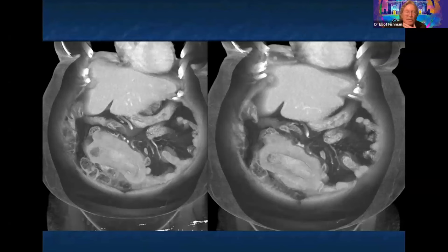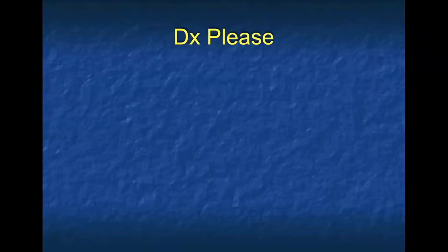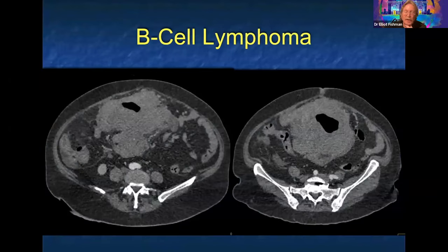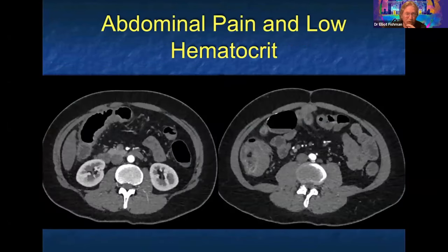Similar but different — another patient with abdominal pain. Answers: GIST and lymphoma. This was B-cell lymphoma. It's much bulkier — I think that's one helpful thing with lymphoma. You often see nodes but not always, but the bulkiness is key. Small bowel lymphoma.